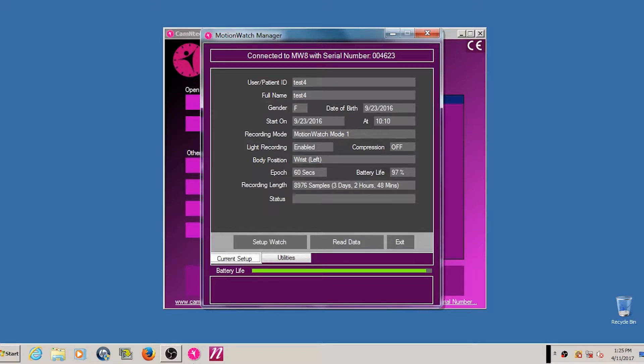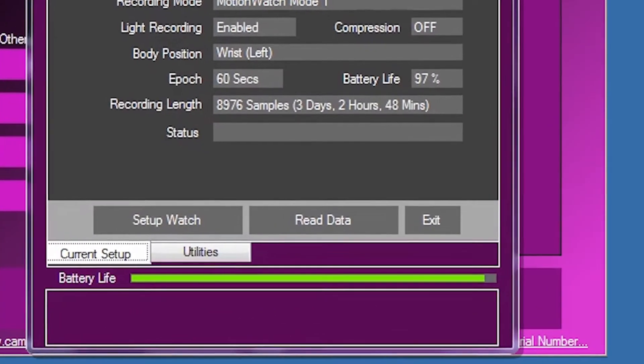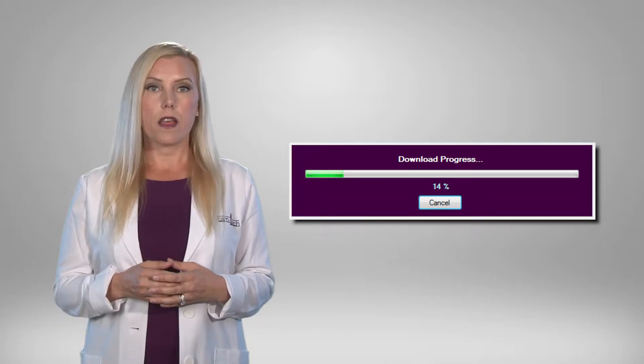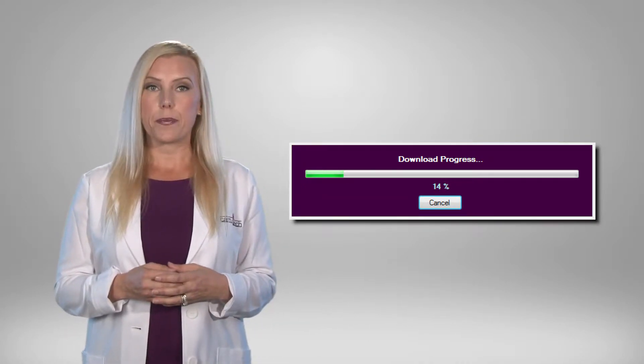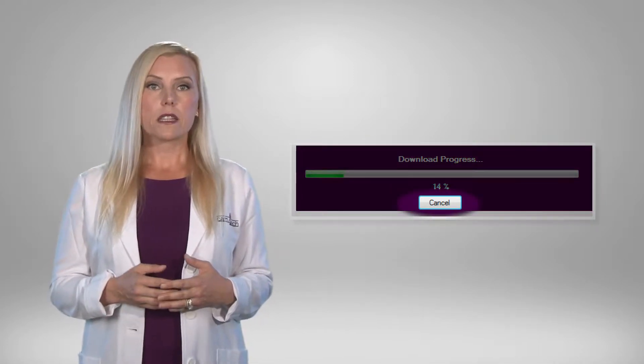From the MotionWatch Manager window, click on the Read Data button. The download will begin and the progress notification will be displayed. If the data download is not required, click the Cancel button and the operation will be aborted.